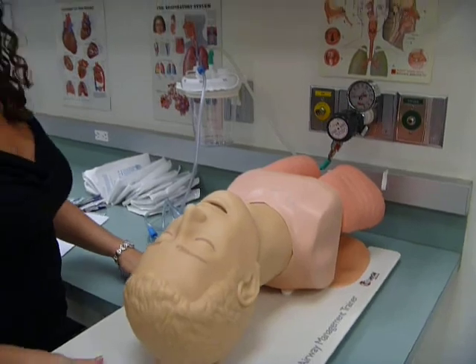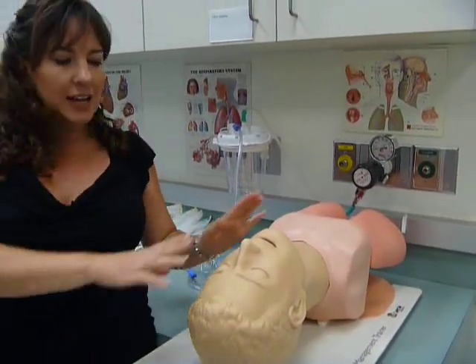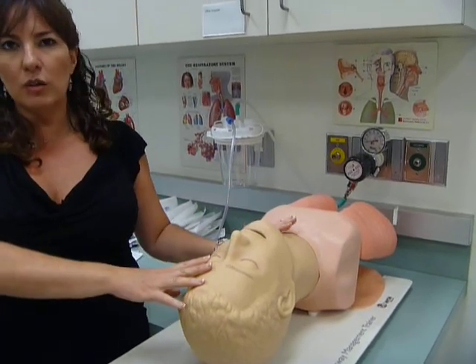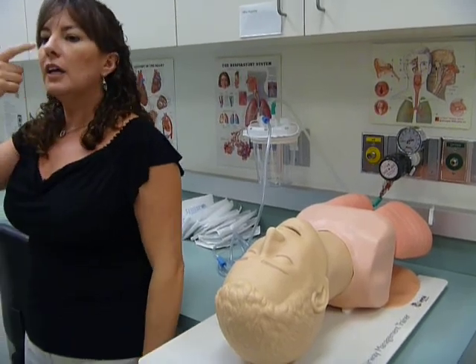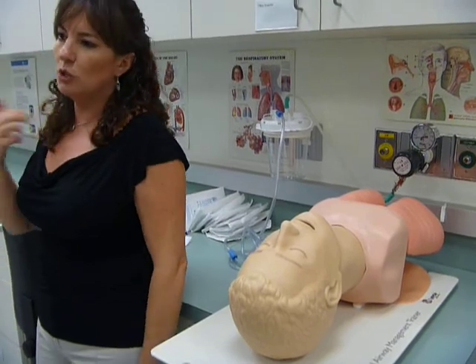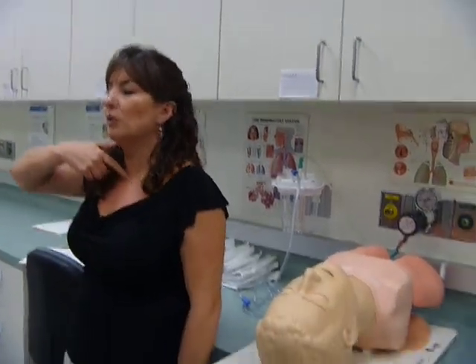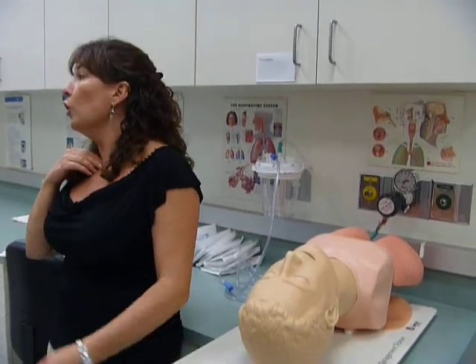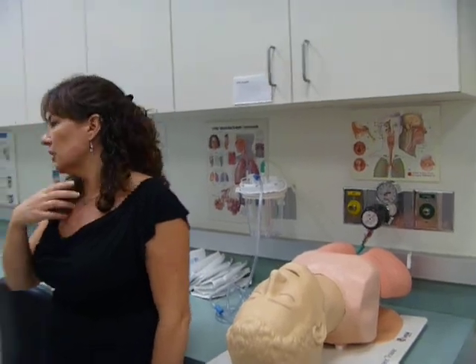So we're going to be doing what's called nasotracheal suctioning. We're suctioning this patient, but this patient does not have an endotracheal tube in or a trach. So we're going to just suction the patient. We're going to go through the nose, into the trachea, and probably into the right main stem, which is usually where you end up. Why do you end up in the right and not the left? Because it's steeper. Right. Because the angle is much sharper on the left, so it's more likely to go into the right. Or you may just end up hitting the carina, not go all the way in. But we're basically suctioning the upper airway.